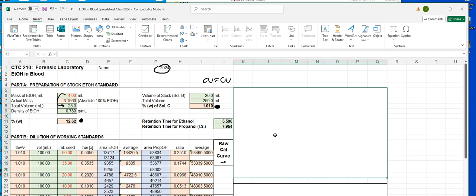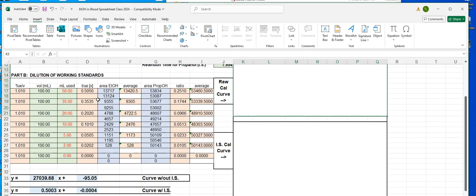So this is one of the reasons that I wanted to show you this method of Excel work, making a cal curve, because up until this point, a lot of your data has been side by side if you've done this before. And the only thing that you had to do was click and drag over. That was it. No more than that.